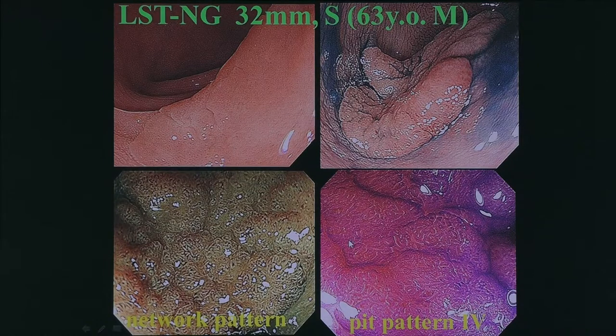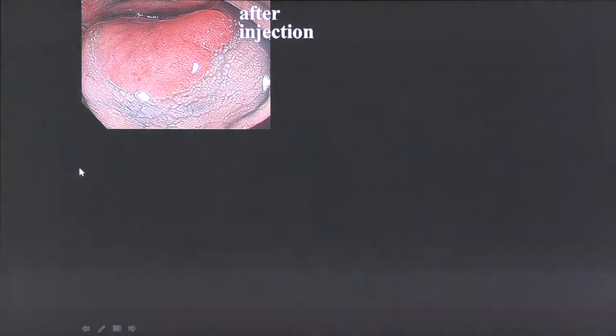Not deeply invasive. Again, I decided to perform EMR and I injected like this.